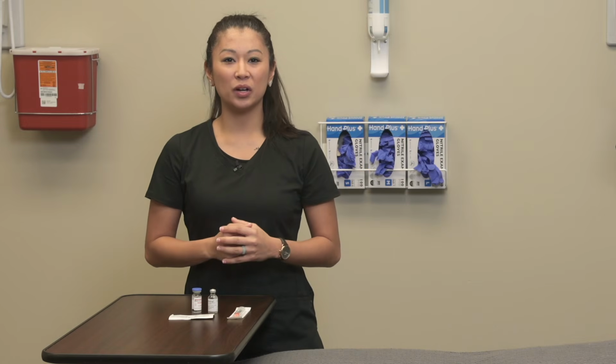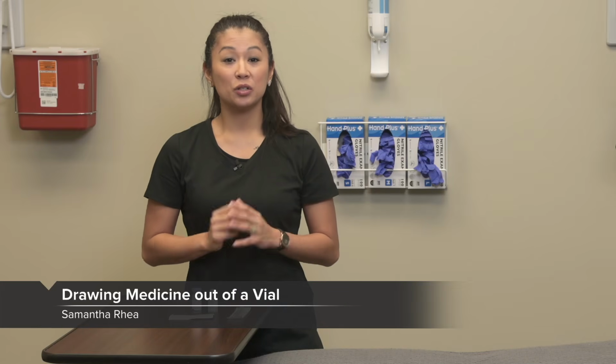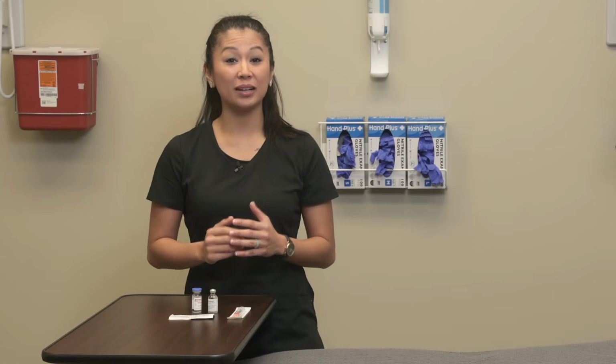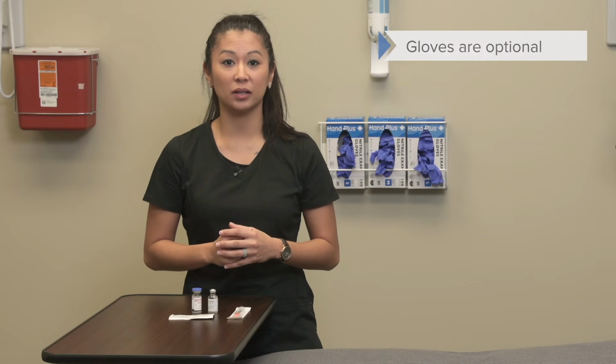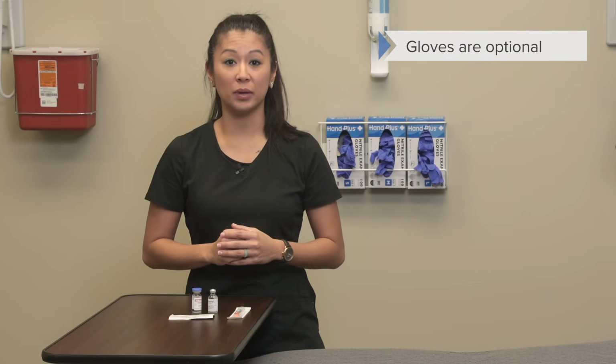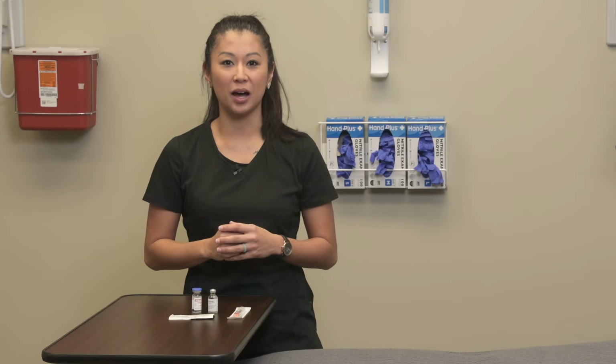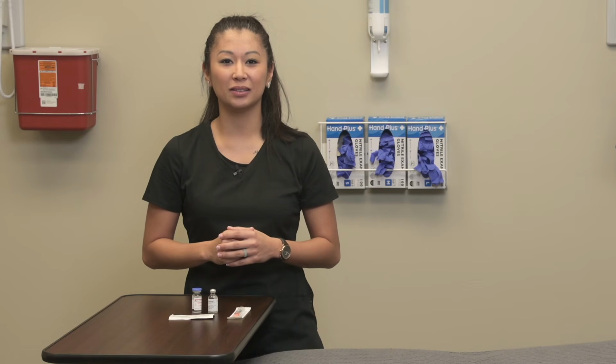Hi, let's take a look at drawing up a subcutaneous medication injection. First of all, I want you to note that I am not wearing gloves. You may have a question about this, but we are actually not providing direct patient care at this point. Therefore, gloves are not necessarily a requirement. If you do want to wear gloves, that is totally okay. It's also going to depend on the type of medication that you are drawing up. So just keep that in mind as well.